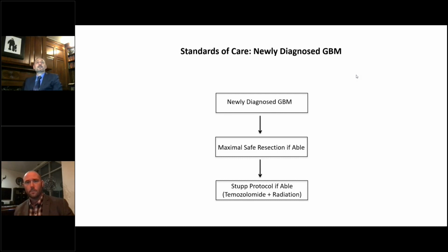Yeah, I think that laser ablation is really agnostic to the type of stereotaxis you use. It certainly can be used with the sorts of frameless systems that you described. I've used it. I primarily use it with the Starfix platform, which is a mini frame. It's certainly been used with CRW and Leksell frames, as well as robotic systems. I know at Emory, Bob Gross is very fond of pairing it with ClearPoint, so you can even use it with the intraoperative MRI-guided stereotactic systems. I think any of those work. You just need an appropriate fitting between your stereotactic system and the bolt driver that you use for the different devices.